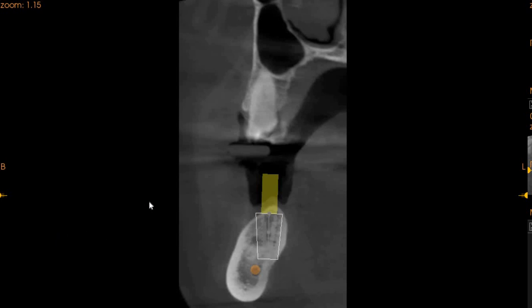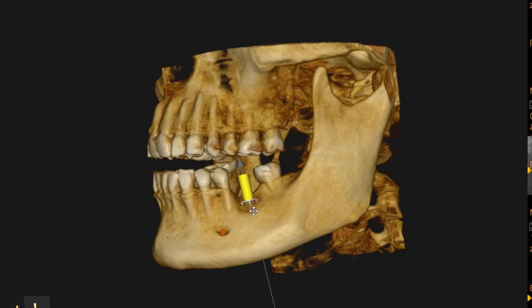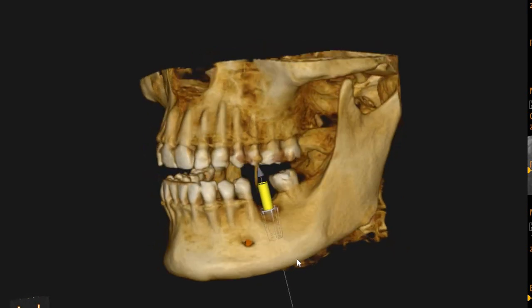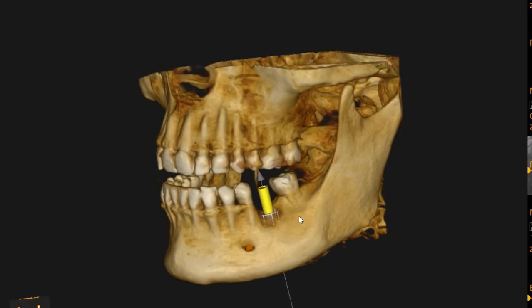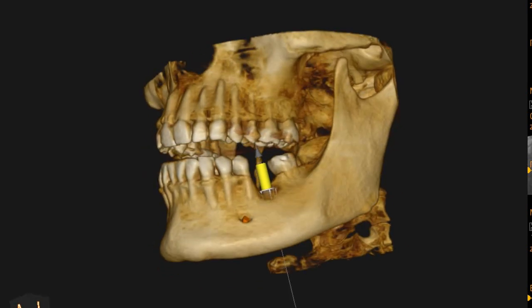Hello and Assalamu alaikum. Ultrascan Diagnostics here. This is the CBCT of the patient that you had requested. The area of interest is the lower left first molar region. This is an edentulous case.